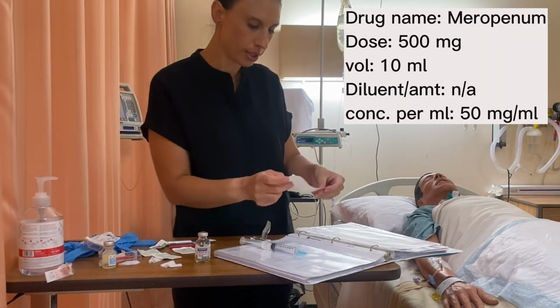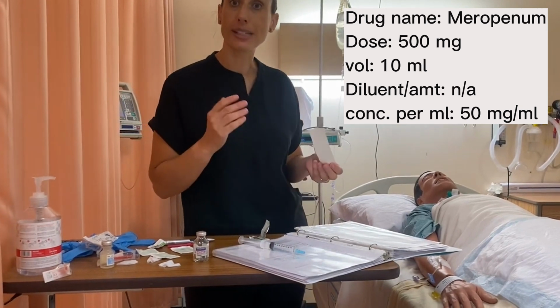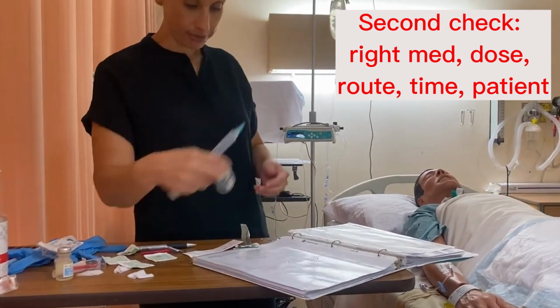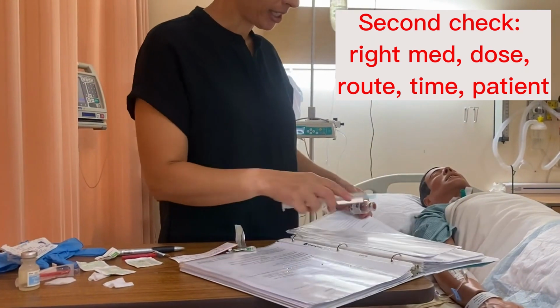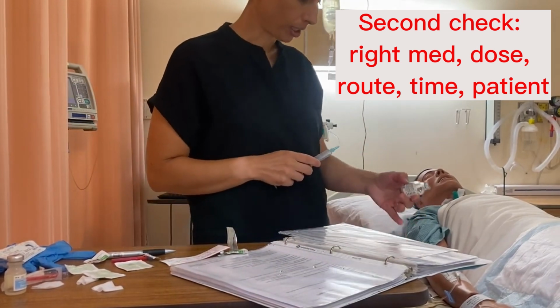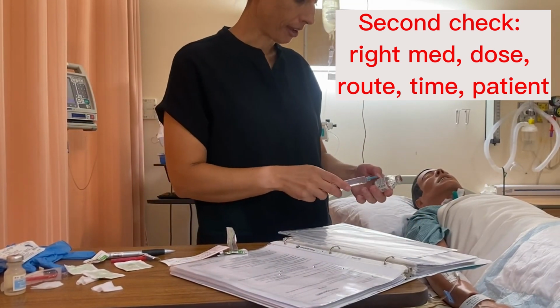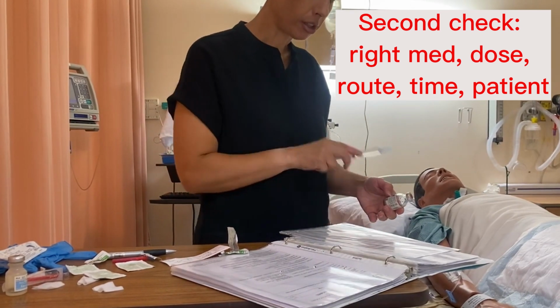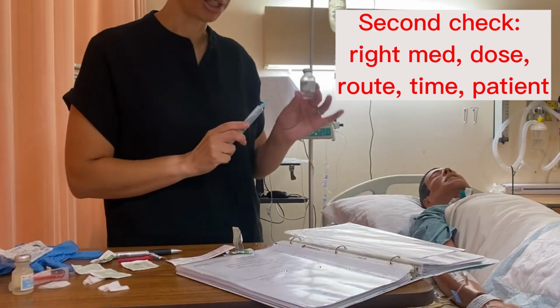So I filled out my label, and then this would be a great time to do our second check. So with my syringe in hand, also with my vial, I'm gonna take a look at my PDM and also my MAR. So my MAR, meropenem, that's what I have here. I have 500 milligrams. It is IV, it is due now, and it is for the patient. So I have done my checks here.